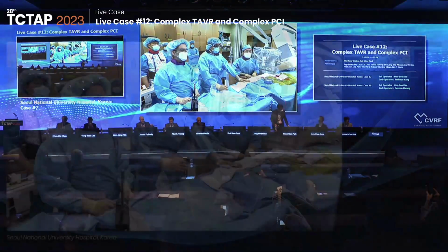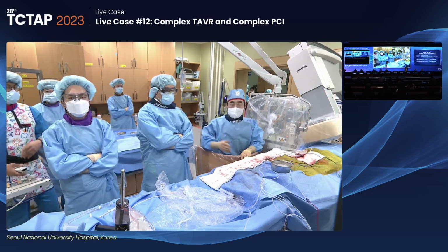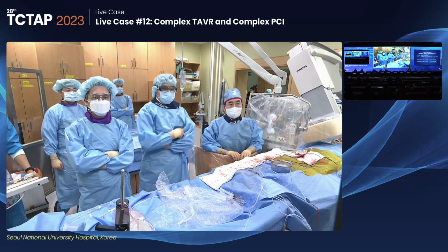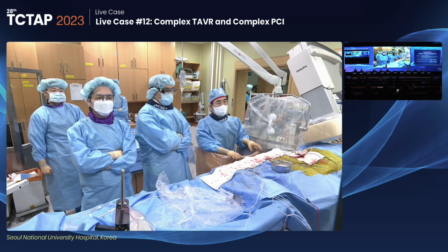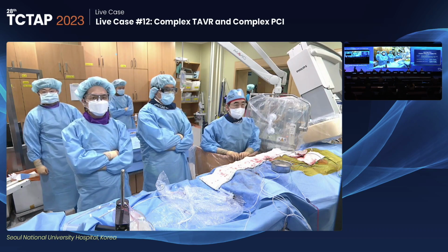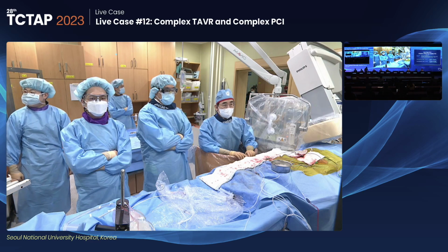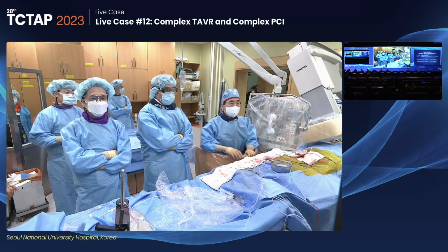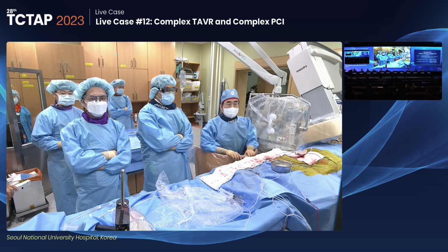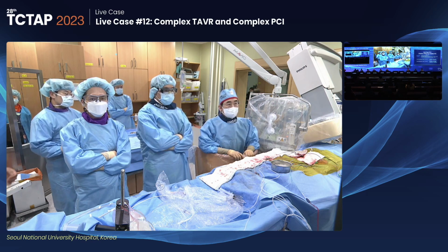Welcome to SNU Hospital. I'm HS Kim. My helpers are Dr. Jeehoon Kang and Ki-Wan Lee. My first case is TAVR with Accurate Neo 2. The second case is a complex PCI with heavy calcification. I just treated the RCA lesion before, and the target of the second case is LAD. Let me introduce the first case of TAVR.